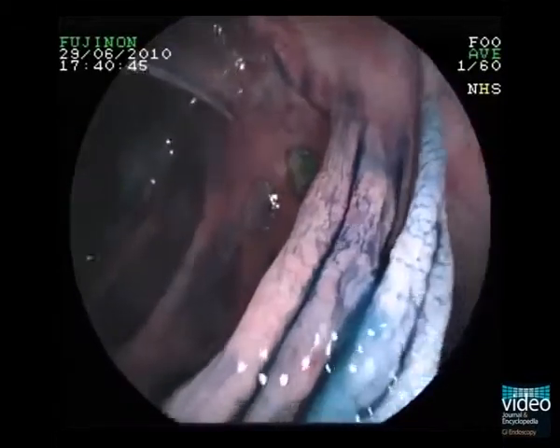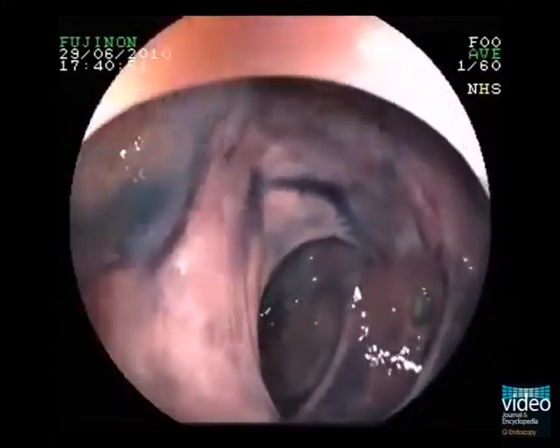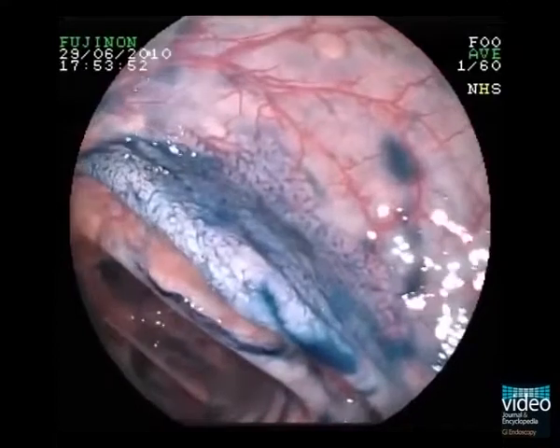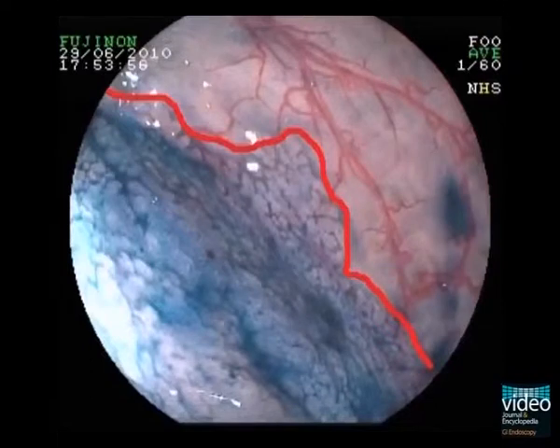Before resection, we withdraw the colonoscope to inspect the rest of the ascending colon. Like in the cases before, chromoendoscopy helps to demarcate lesions that were not detected before without dye. This type 2 lesion here is nearly invisible without surface enhancement — it is just the pit pattern that shows the margins to the regular mucosa.